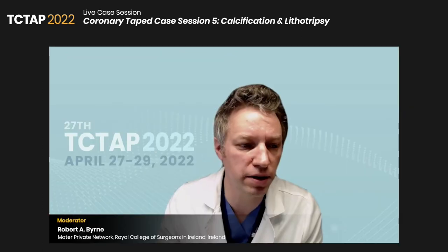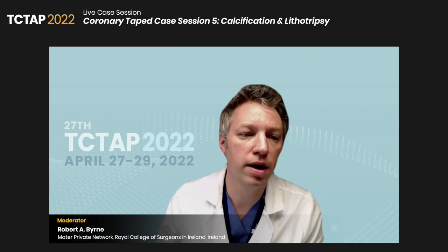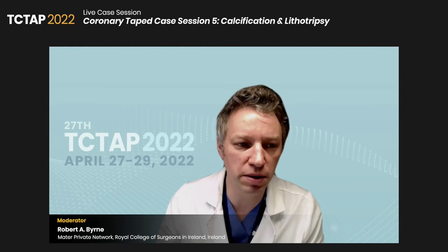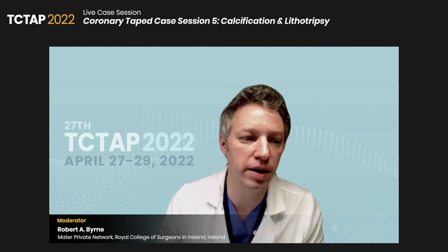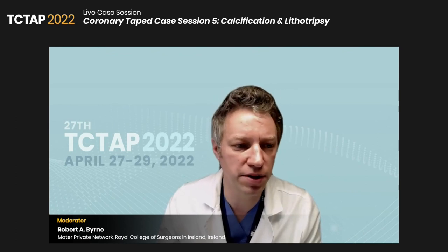So I think in the interest of time, unfortunately, we've run over slightly. And I think there were some very important learnings: the meticulous attention to detail, modify, check, repeat, modify, check, repeat. I think use some form of intravascular imaging is a take home. How you combine atherectomy with lithotripsy will depend on the distribution of calcium. I'm sure it'll be impacted by your local reimbursement models. But some very important take-home messages from that session.